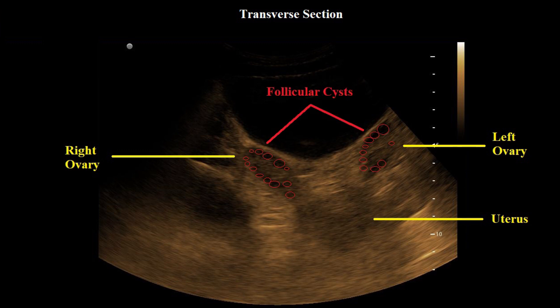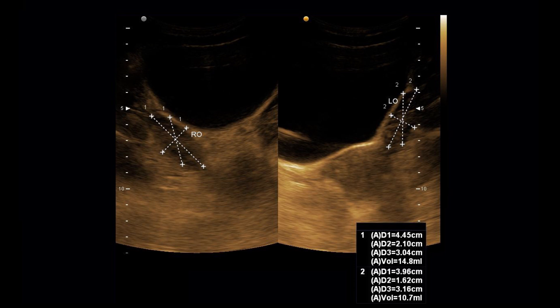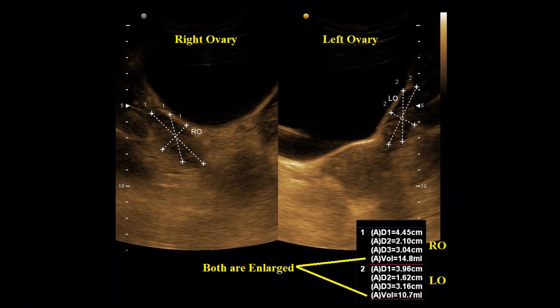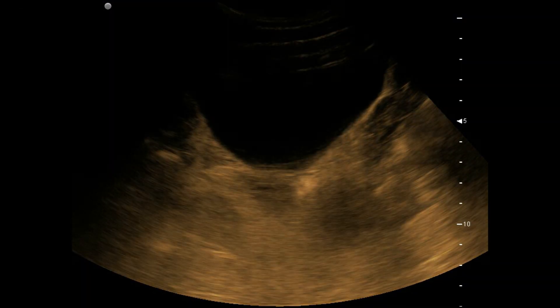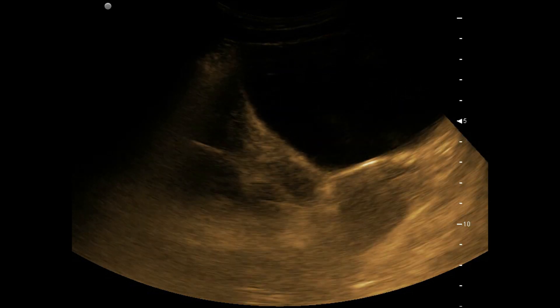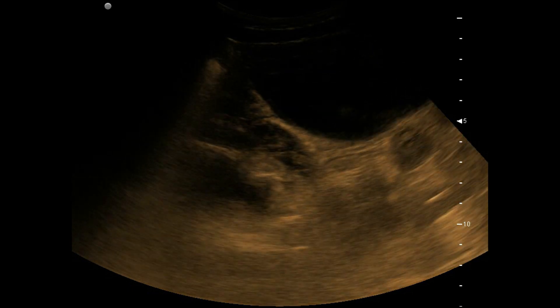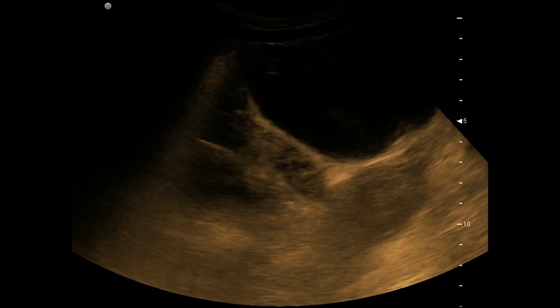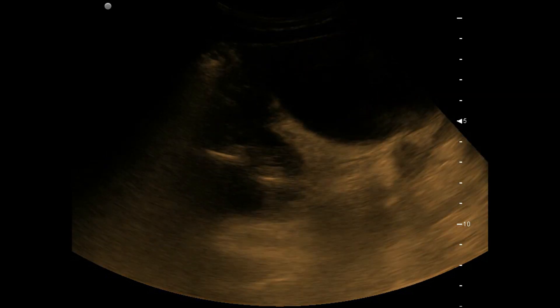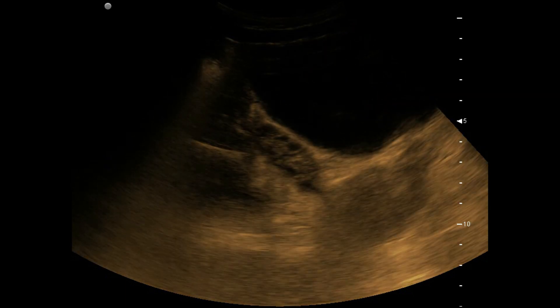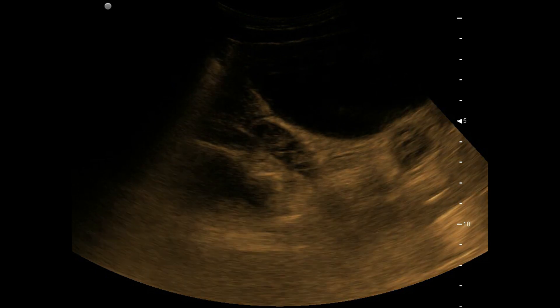No dominant follicle is noted. After measurement, we can see the ovaries are enlarged bilaterally. On real time, you can see the left and the right ovaries with typical pearl string appearance — enlarged with pearl string appearance and without a dominant follicle, consistent with polycystic ovaries.